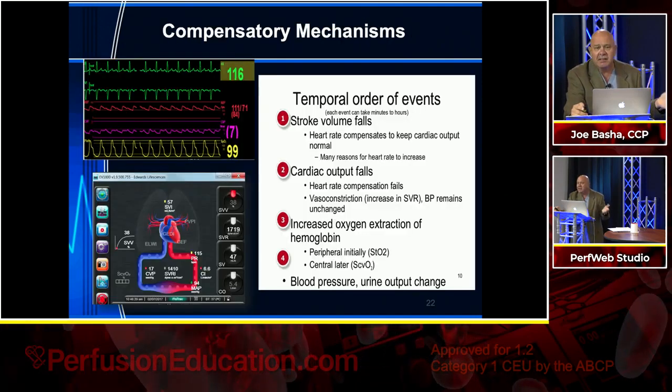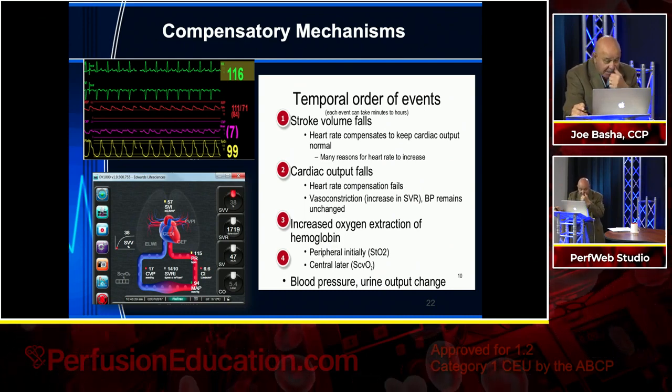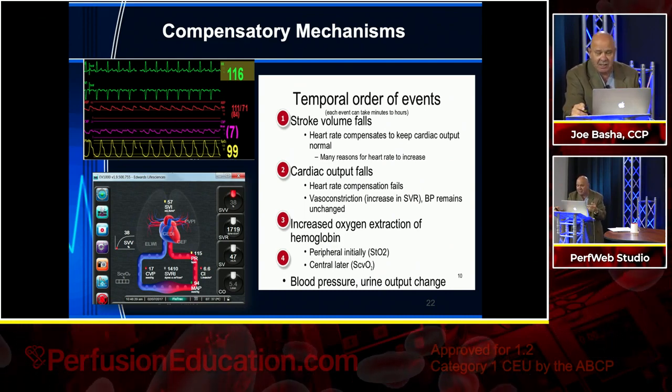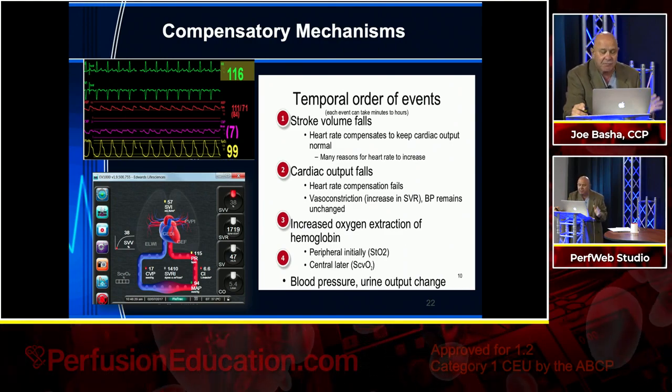So I want to talk about the compensatory mechanisms. And this device that you see here on the bottom left, the top is just a hemodynamic monitor. That's the Edwards EV1000, just so you know.